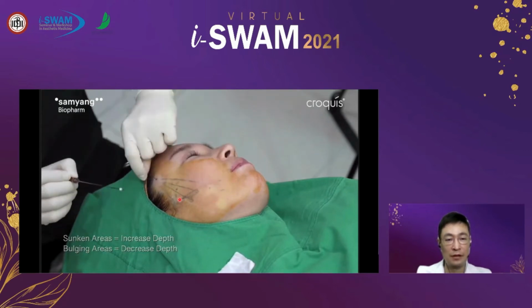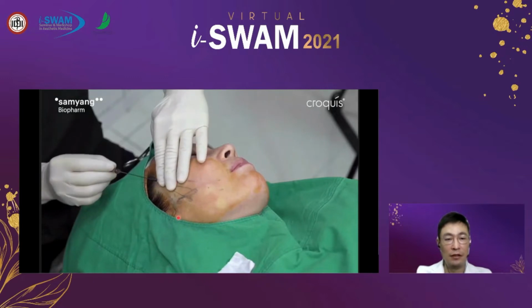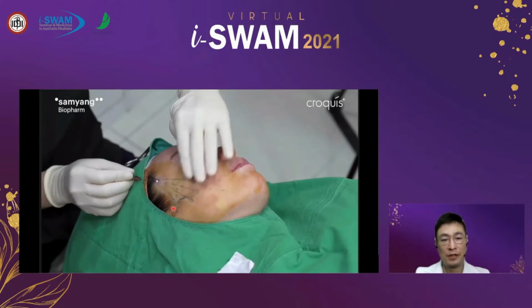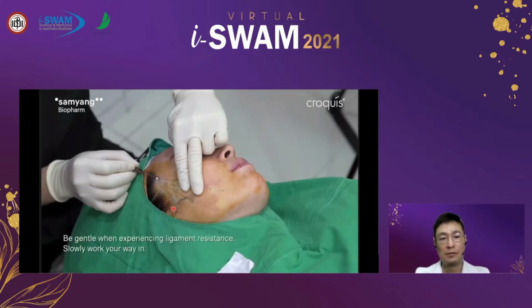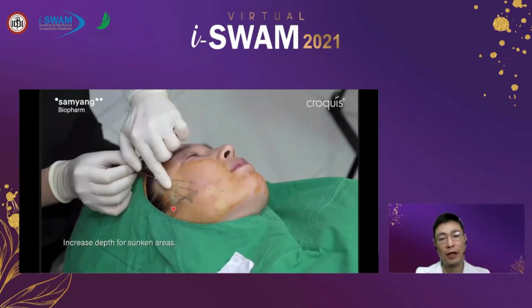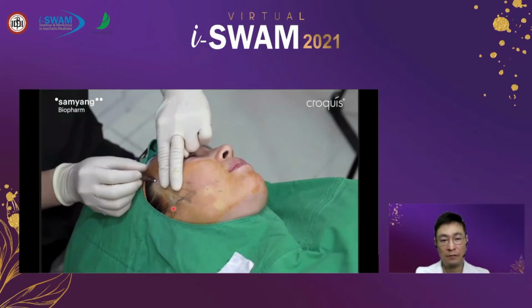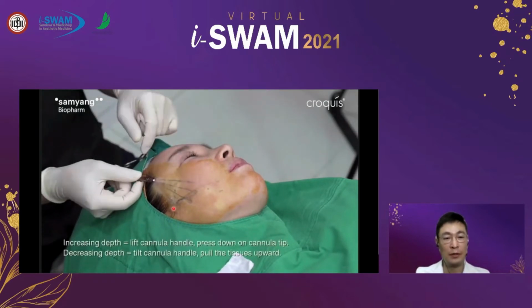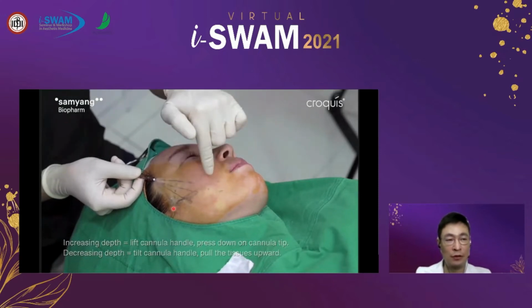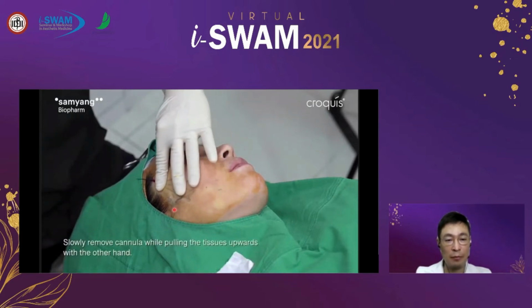So to prevent sunkenness of the lateral cheek, you may keep your cannula parallel to the skin surface. Where the skin is bulged, you advance a little shallower, and where there is a sunken area, you should advance the cannula a little bit lower, a little bit deeper. But do not penetrate or touch the SMAS. Severe bleeding may happen.